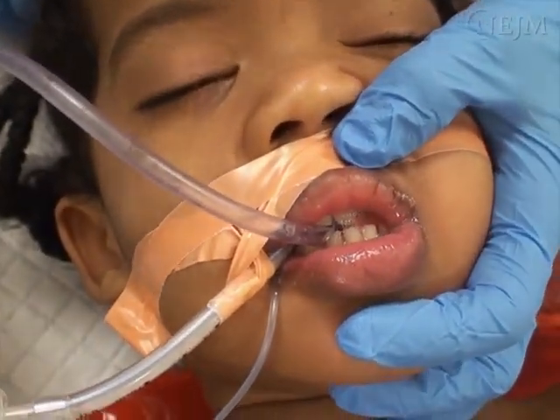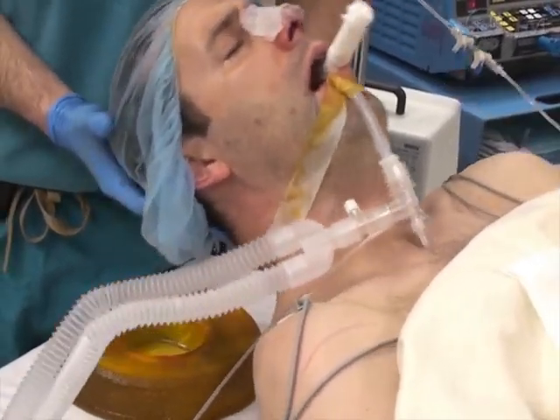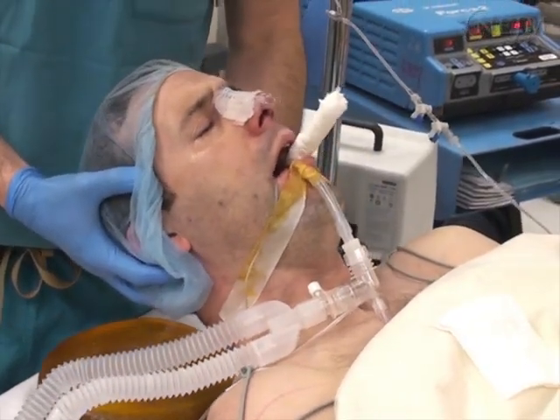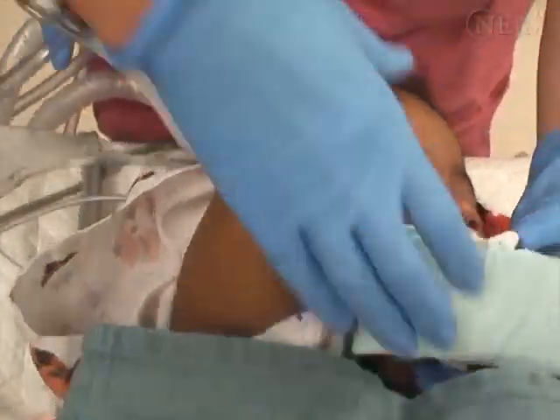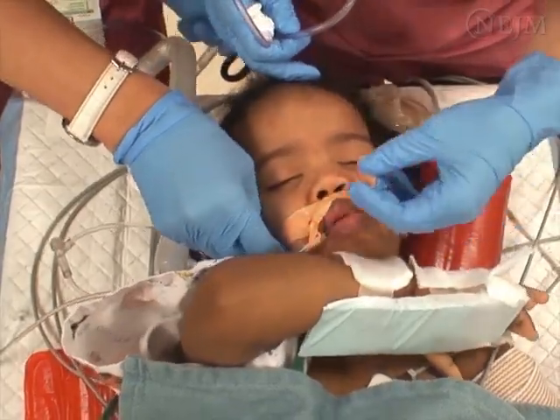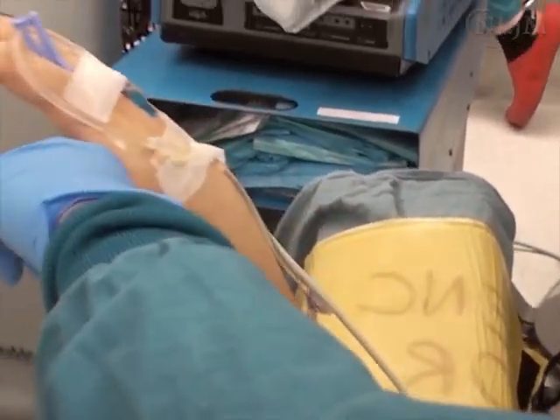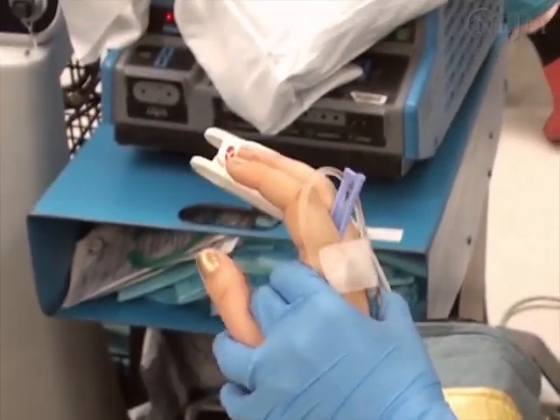to be postponed. Patients emerging from general anesthesia often make forceful, uncoordinated movements just before they are ready for extubation. Therefore, it is vital to protect the position of the endotracheal tube to keep the patient from accidentally self-extubating, which could cause hypoxemia. In addition, the patient's fingernails or objects such as the pulse oximeter could cause abrasions to his or her corneas if the arms and hands are not secured.